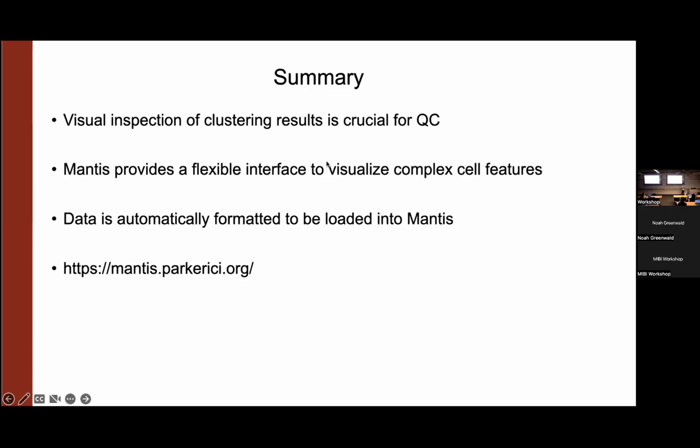And so that's why we are so careful with doing everything in a single batch at the same time under the same conditions to, as much as possible, reduce batch effects, because then it really does throw a big wrench in your analysis. That's why we spent such a long time coming up with this new normalization scheme for the MIBI data specifically. As a result of this, I now was able to set a single threshold for PD1, PDL1, KI67, CD38, TIM3, TCF1 across my entire cohort, because the remaining differences in intensity were small enough that they didn't cause me to pick a different threshold.